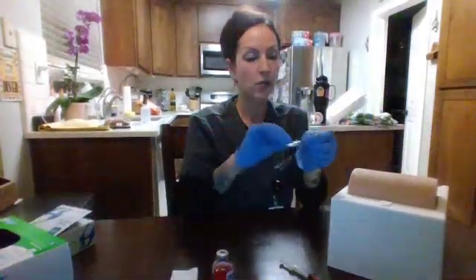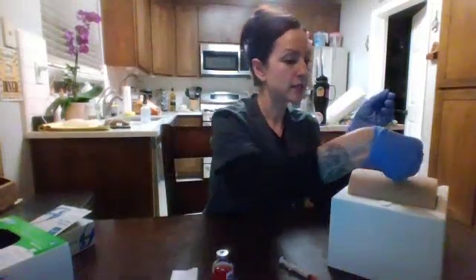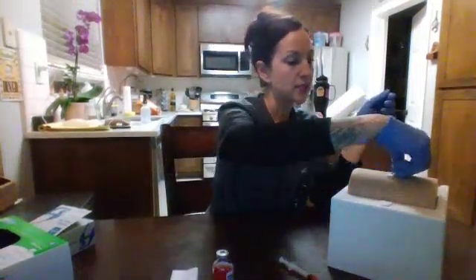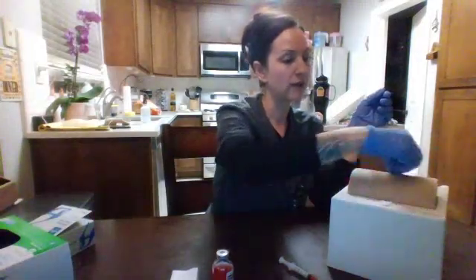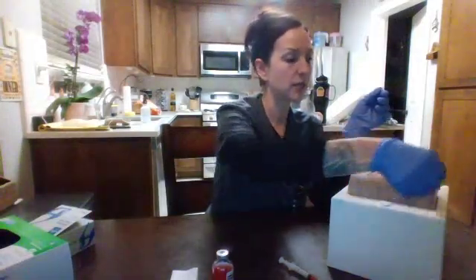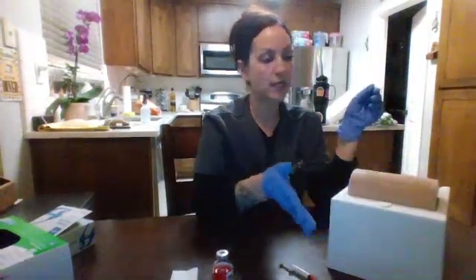I'm going to get an alcohol prep pad and I'm going to place it directly in the center of my chosen site. And in an outward circular motion, roughly 5 centimeters or 2 inches, I'm going to clean the area. I'm going to allow that to dry completely. I'm not going to wave my hand or blow on it.